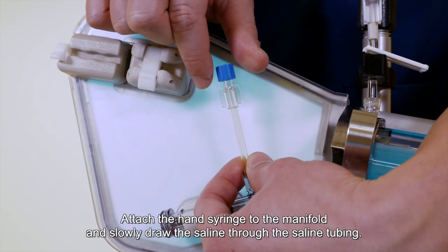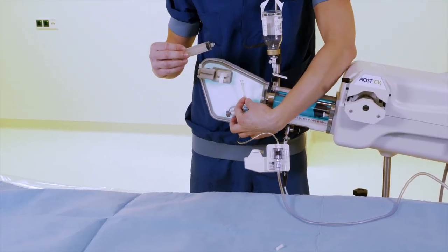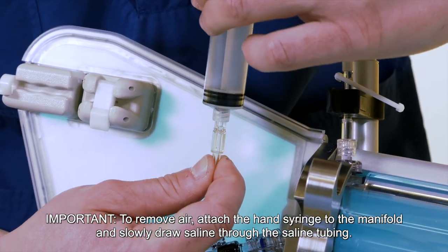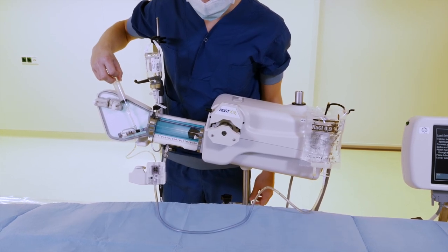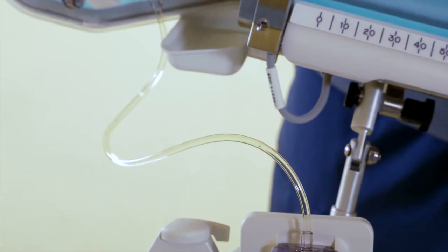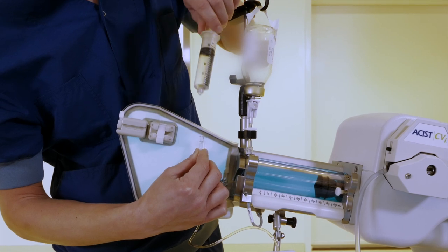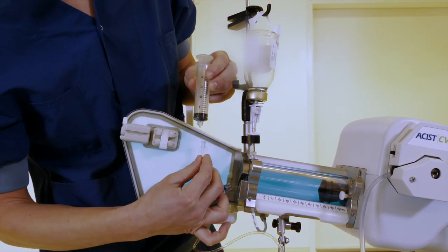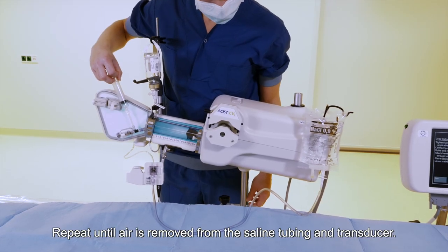Step 3. Attach the hand syringe to the manifold and slowly draw the saline through the saline tubing. Important: to remove air, attach the hand syringe to the manifold and slowly draw saline through the saline tubing. Repeat until air is removed from the saline tubing and transducer.